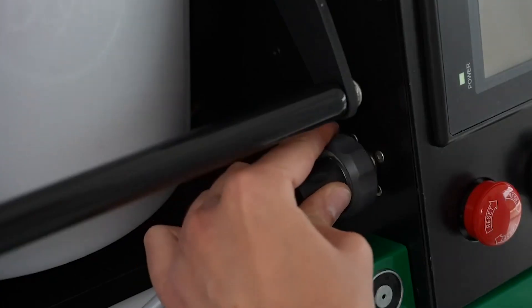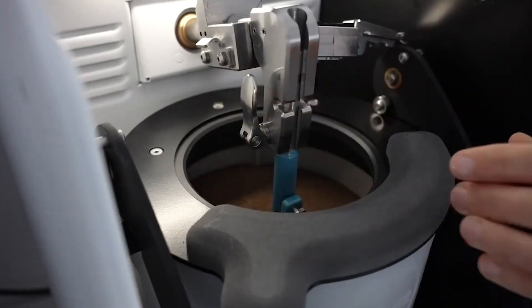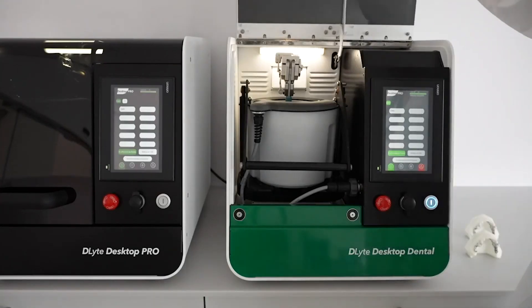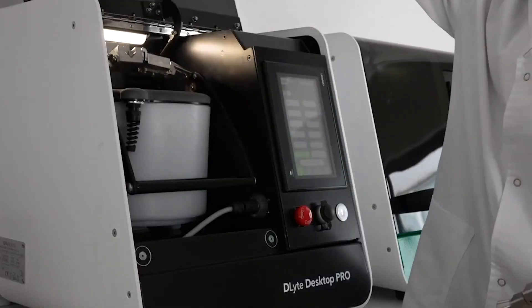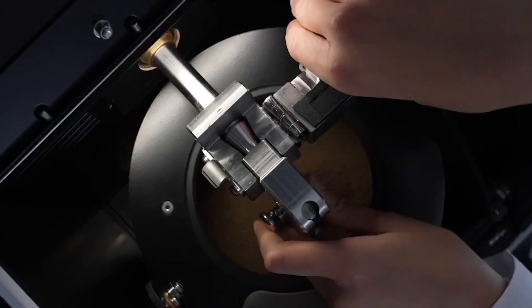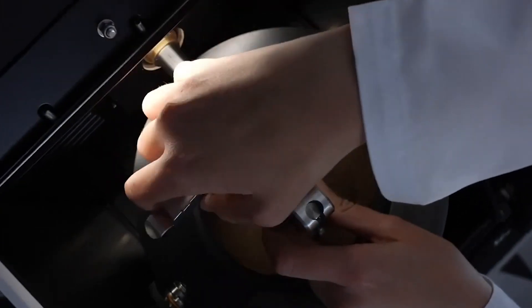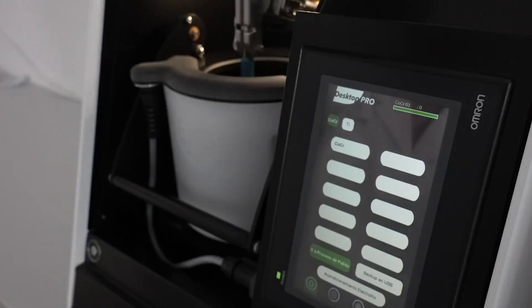D-Lite Desktop Series are available in two versions. D-Lite Desktop Dental, aimed at dental laboratories and designed for the treatment of cobalt chrome pieces such as removable partial dentures, bars, and crowns. And D-Lite Desktop Pro, designed for the treatment of a wider variety of materials such as cobalt chrome, titanium, stainless steel, aluminum, copper, and nickel, to meet all of your production needs.